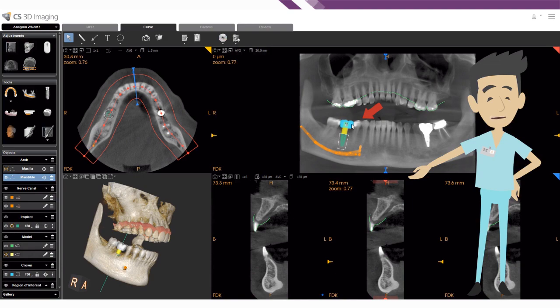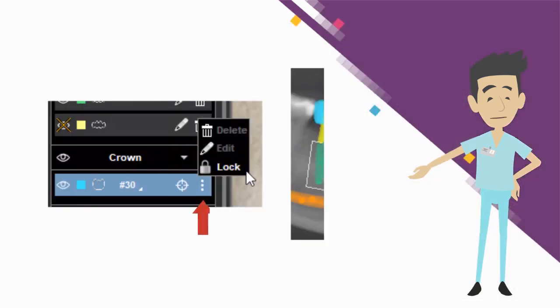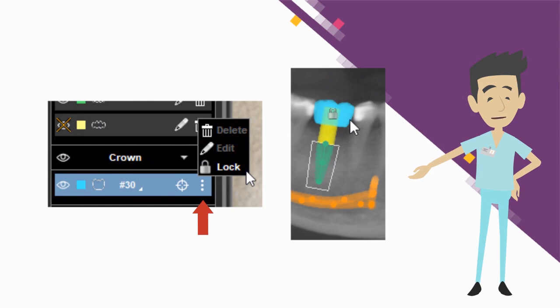When an object is placed inside the volume, click on the three dots inside the toolbox and select lock. A padlock appears over the object in the image. The object cannot be moved until unlocked.